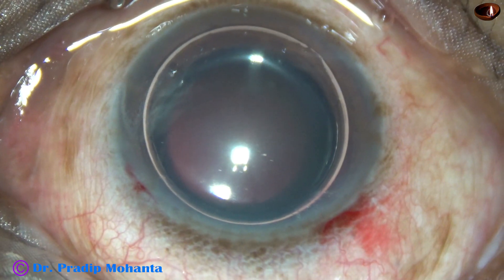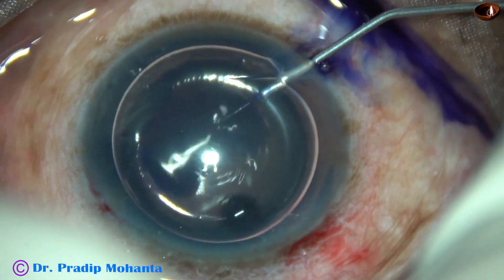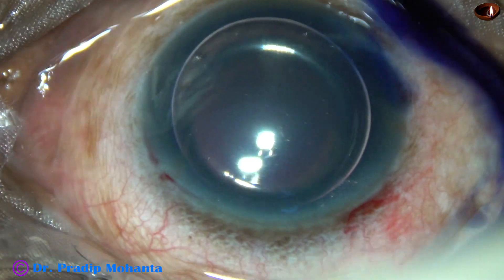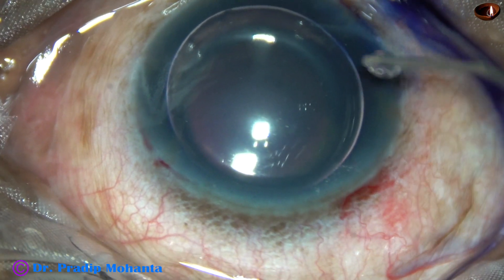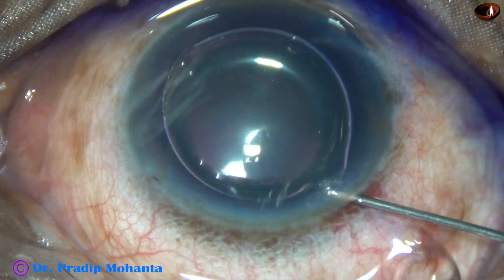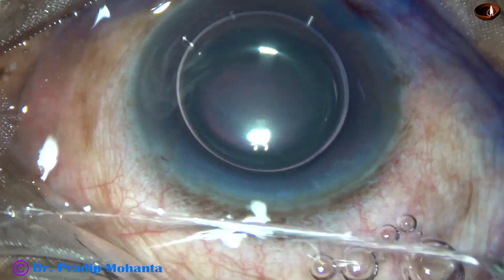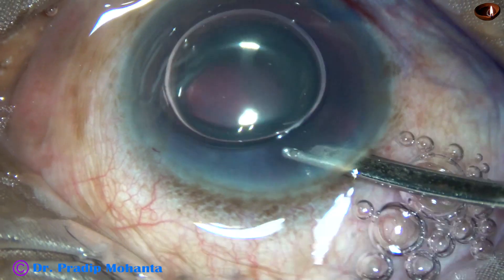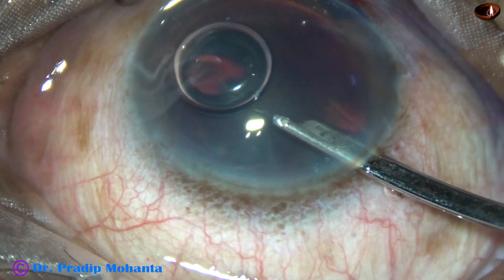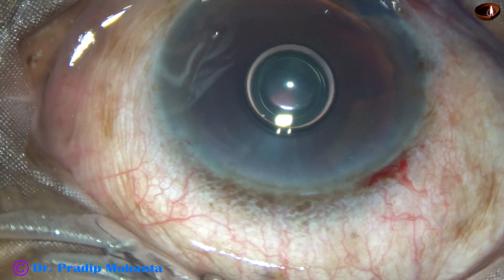Now my aim is to stain the anterior capsule with Trypan Blue Dye. An air bubble is injected. Beneath this air bubble, Trypan Blue Dye is applied over the anterior capsule. Without much delay, this is a bit of adrenaline to help maintain dilatation of the pupil. And now the dye is washed out. And see, within a very short time, there is nice staining of the anterior capsule.